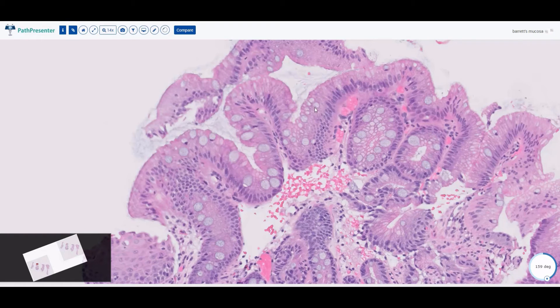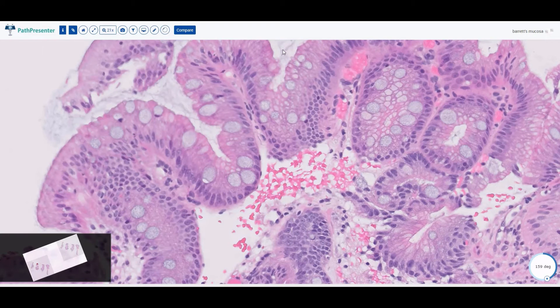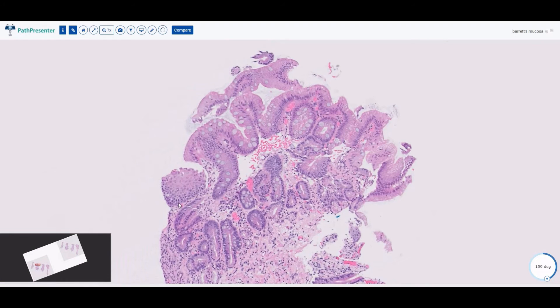Then the foveolar epithelium starts acquiring features of intestinal epithelium — specifically goblet cells. Within this area you still have your lightly pink foveolar epithelium, but within it you also start to see larger, translucent grayish mucin droplets: those are the goblet cells. When you have this occurring within foveolar epithelium, that is called intestinal metaplasia. A biopsy like this — with squamous and foveolar epithelium — would be reported as squamous-columnar epithelium with intestinal metaplasia. On endoscopy, the finding of an irregular Z-line or salmon-colored patches in the distal esophagus near the Z-line confirms that this is truly esophagus.